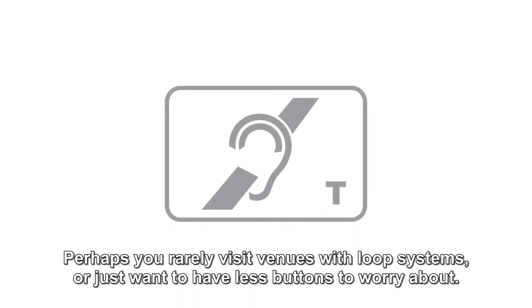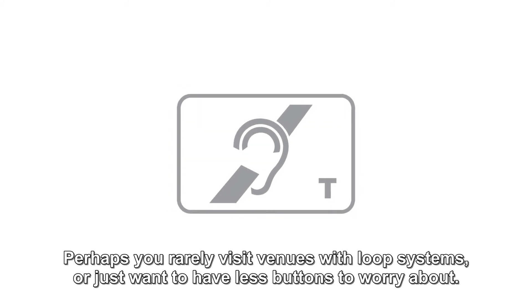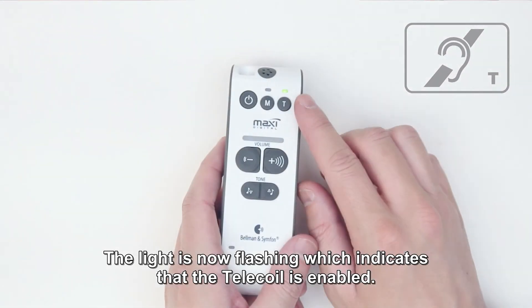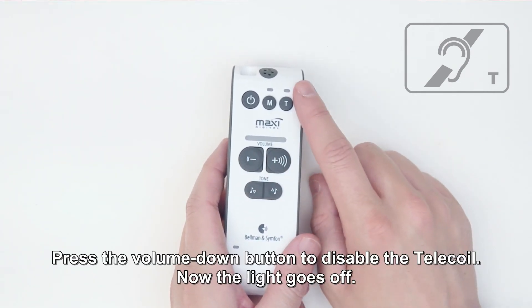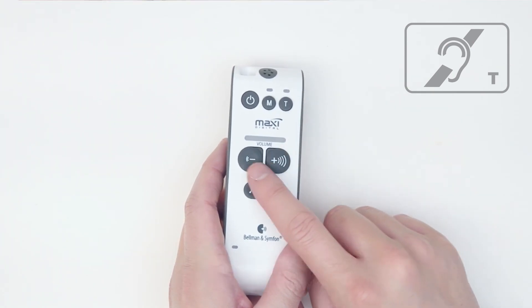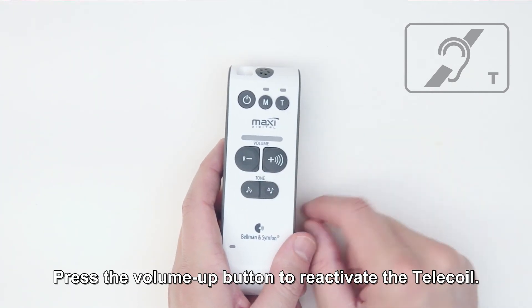Disable telecoil. Here you can disable the telecoil — perhaps you rarely visit venues with loop systems, or just want to have fewer buttons to worry about. The light is now flashing, which indicates that the telecoil is enabled. Press the volume down button to disable the telecoil; now the light goes off. Press the volume up button to reactivate the telecoil.